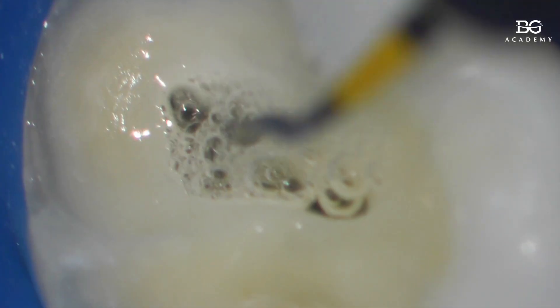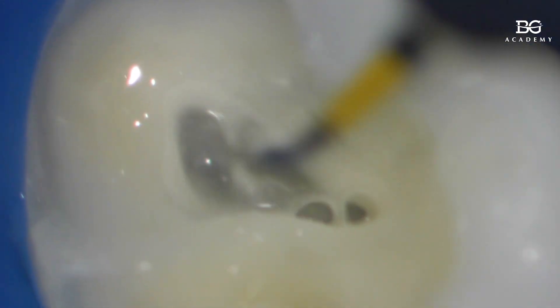Now we'll pour sodium hypochlorite here and activate it with ultrasound again with the same device to clean it. There's a lot of debris in there and visualization is severely limited. Right now we're not touching the bottom with the file at all — just working inside like this, in the liquid. Yes, we activated it a bit, then dried it.